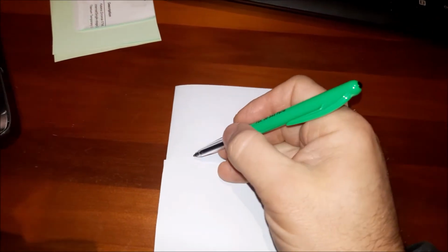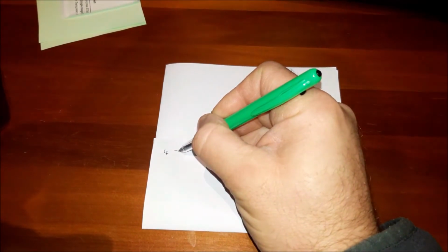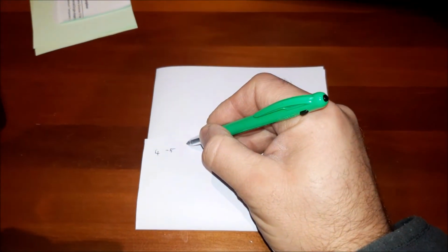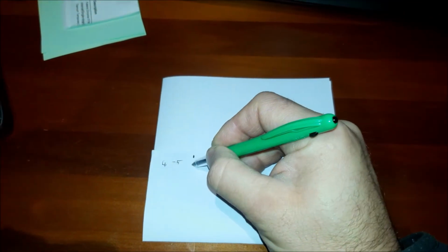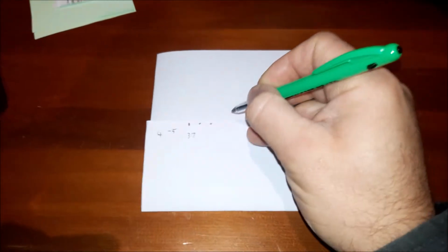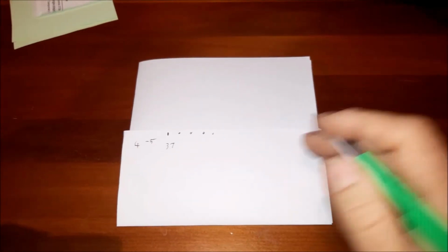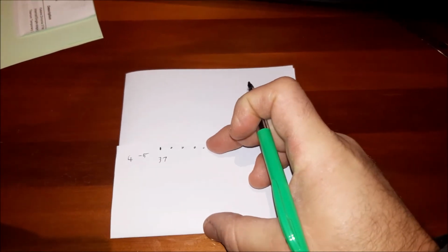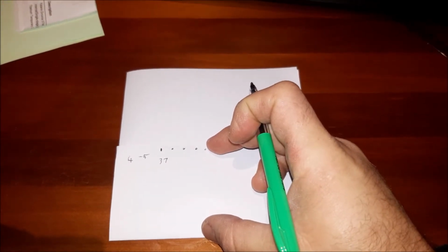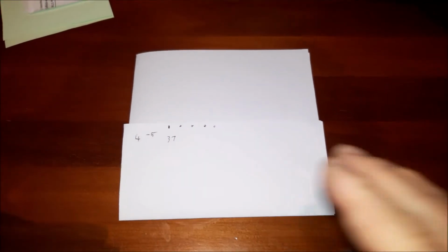Now for the lower rubber dam, we start also at a point in the vertical middle, 4 to 5 centimeters from the side, and I'm illustrating the third quadrant here. That would be 3-7, 3-6, 3-5, 3-4, 3-1, thereabouts. Notice how this is close to the same opening as a mouth on average. So the lower ones basically go horizontally.